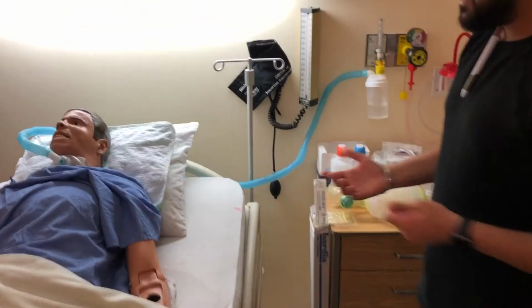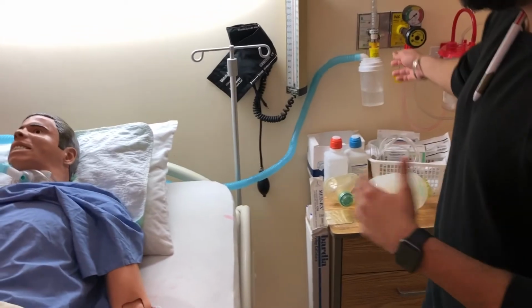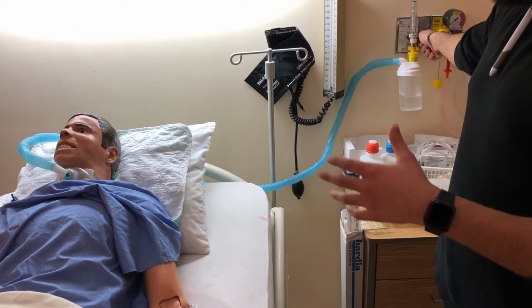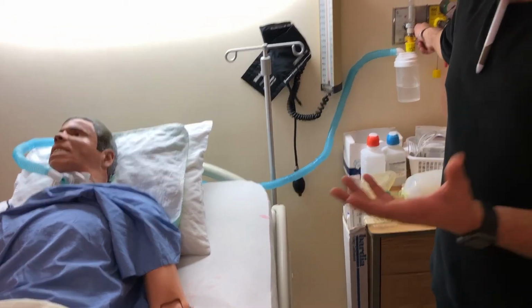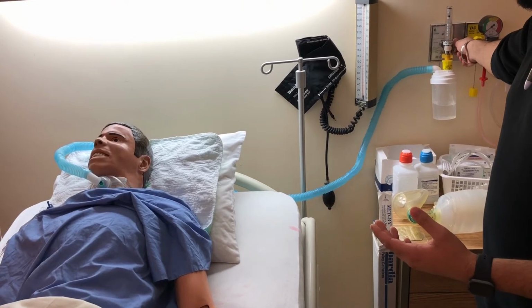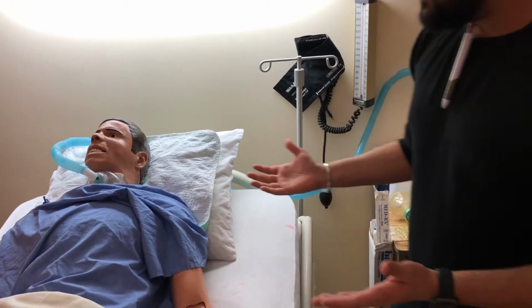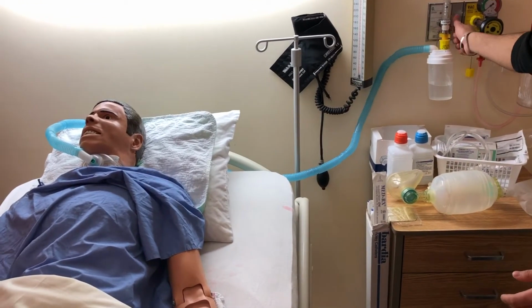I would say, hey, my name is Karen, I'm a student nurse. I'm going to be doing your trach dressing. I'm going to be oxygenating you right now, so I'm just going to increase the 15 liters for about 15 to 20 seconds, just until they take 2 to 3 deep breaths. So I'm just going to increase this, 15 liters. Take 2 to 3 deep breaths. They do that. They are oxygenated now.